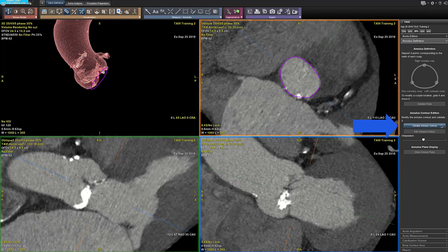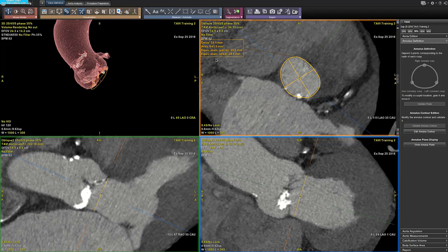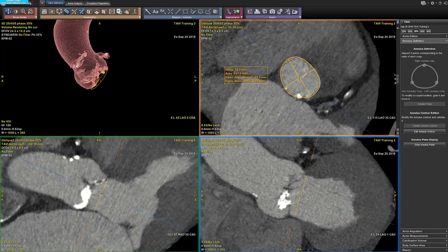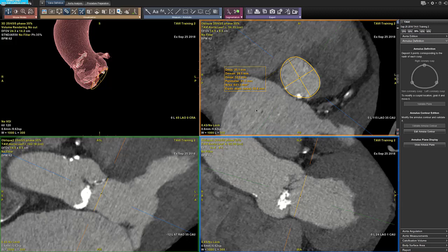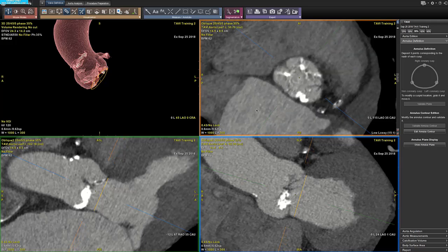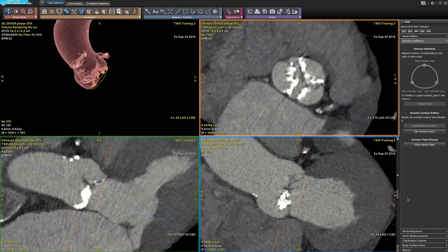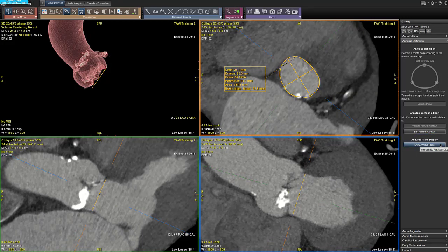Once your contouring is completed, you can click on the validate annulus contour button in the wizard panel. You get all the measurements for the annulus contour on the upper right viewport. You can right click on the measurements to either delete one or several of them, or select the ones you want to see by checking or unchecking some statistics. All that information will be saved on the summary table and on the report. You can use the show annulus plane button to find the plane back if you have moved orientation and lost the plane.